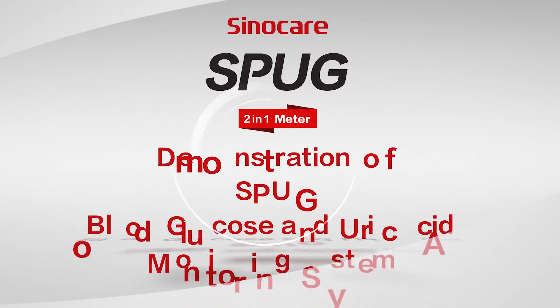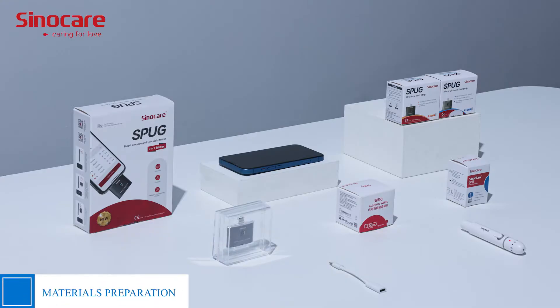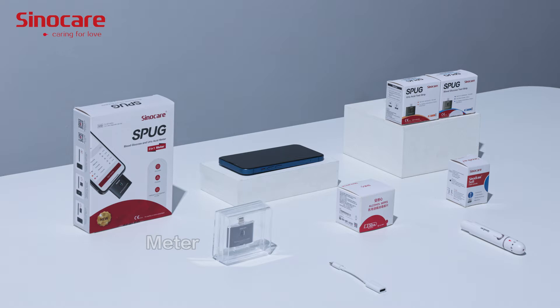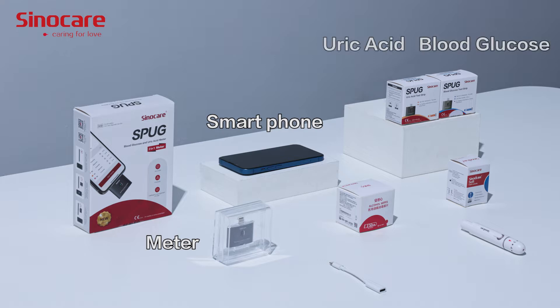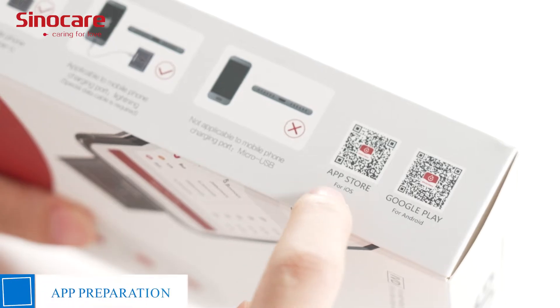Demonstration of the SPUG Blood Glucose and Uric Acid Monitoring System. Prepare the components you will use: the SPUG Blood Glucose and Uric Acid Meter, Blood Glucose Test Strip, Uric Acid Test Strip, lancing device, lancet, 75% alcohol pad, and the SPUG Transfer Light app.